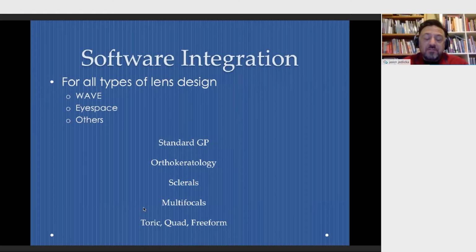We've really just scratched the surface on the applications it has for anterior segment disease, but in terms of contact lens fitting, especially as we're using more and more scleral lenses, the Pentacam has increasingly more options for scleral lens fitting that can be extracted from the data, as well as software that integrates with the data to actually do the lens design for you. And so I want to switch over to a brief discussion of software integration with both of these instruments.